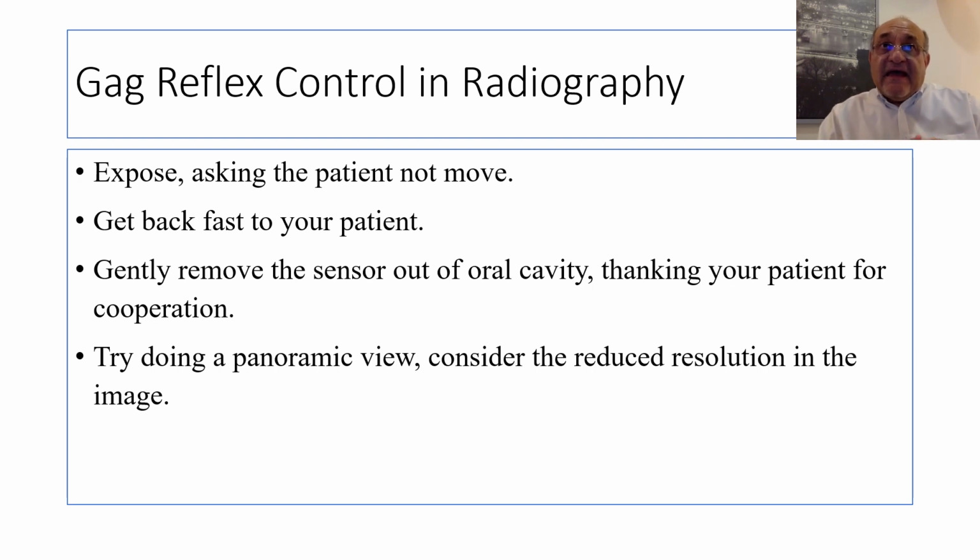And if you have the chance to do, or if you have a panoramic machine, OPG machine in your clinic, and you feel that the patient is not cooperating, though you have followed those steps, I'm quite sure if you follow these steps, you will notice that there will be minimum gagging, if not at all. I've tried this several times, and the gagging reflex can be completely eliminated by being gentle and fast in your procedure.